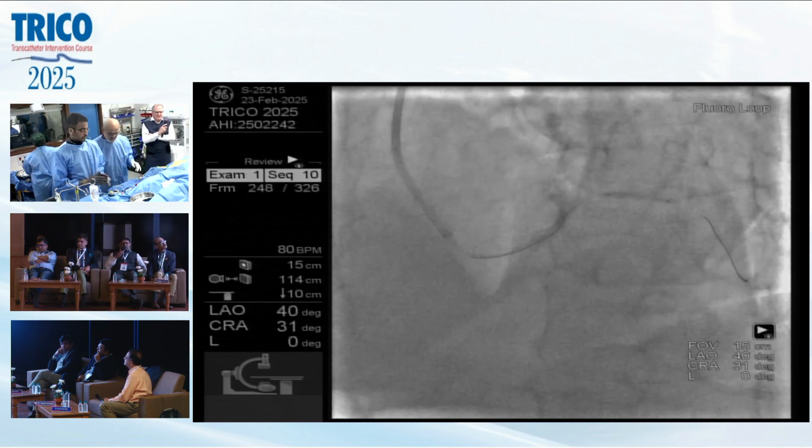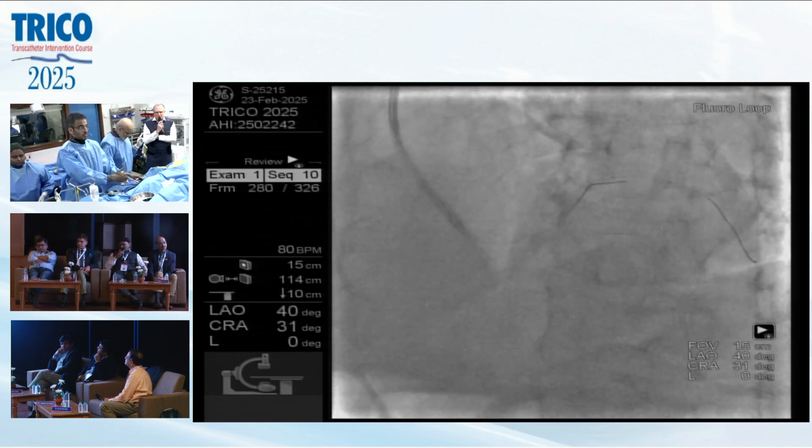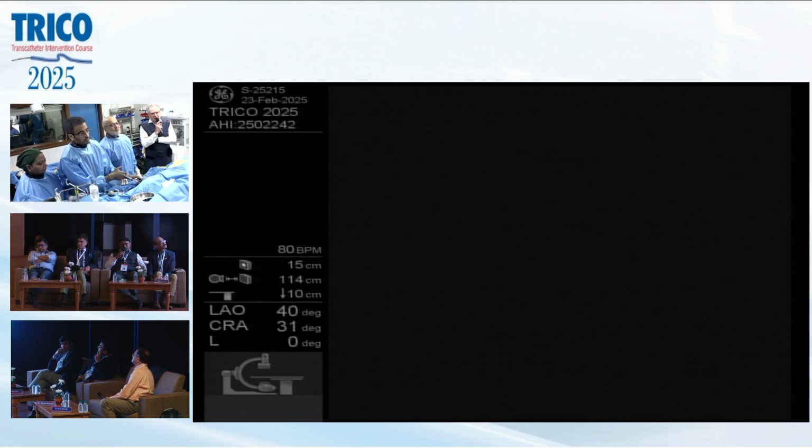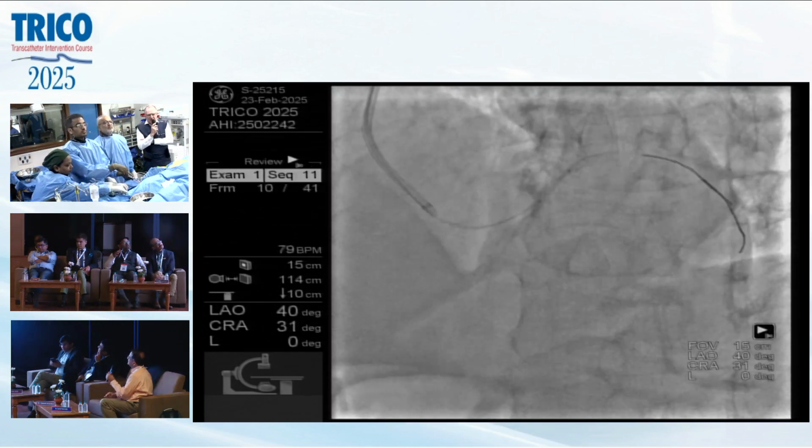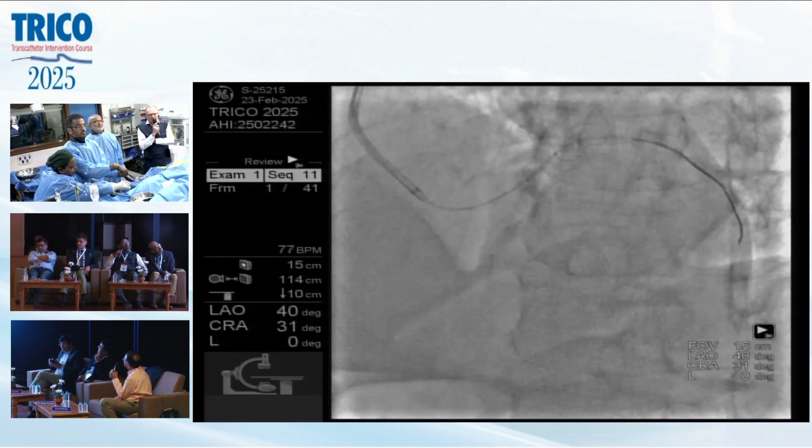Now let us check it. That's such an important point, and there was a period a few years ago where I was doing a lot of 5 French PCI. You just have to do that, otherwise sooner or later you will run into problems.